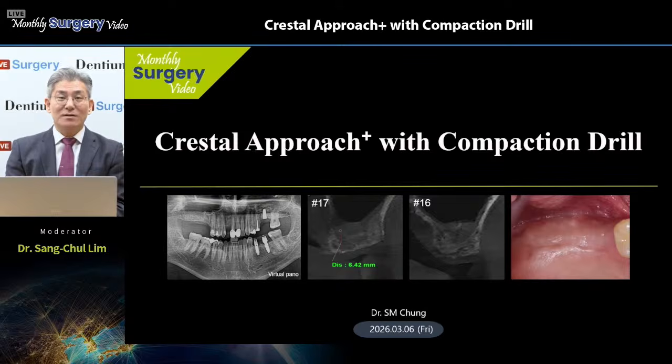As mentioned in our previous session, our new format, monthly surgery video, begins with a follow-up from the previous case. After that, we will present this month's surgery procedure. As always, the surgery was performed by Dr. Chung today. Today's topic is Crestal approach plus with compaction drill. Through today's procedure, you are able to learn how to perform Crestal approach of the sinus elevation, especially using the DASC simple kit. Now, let's take a look at today's case.